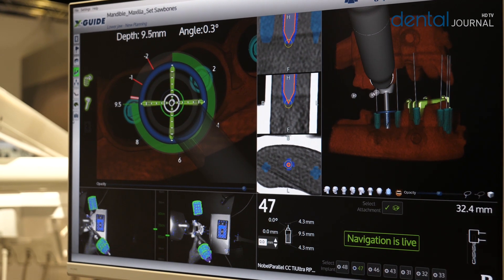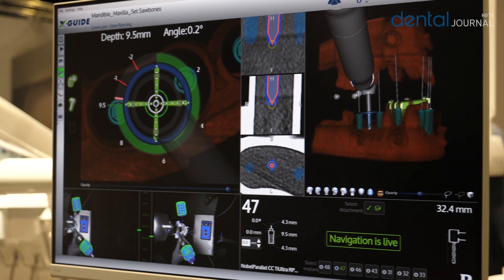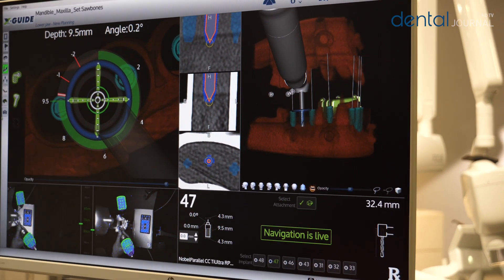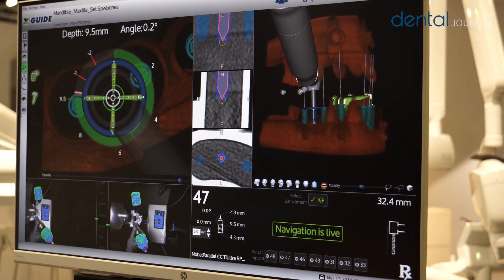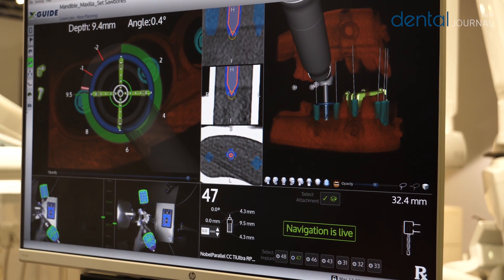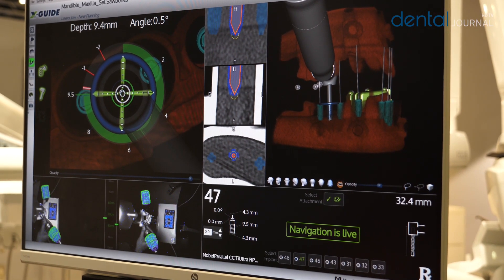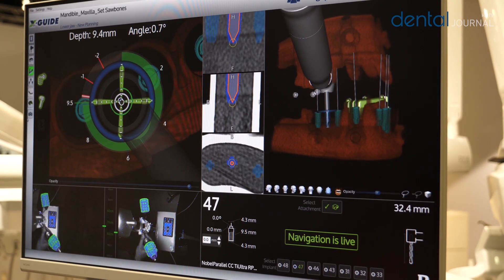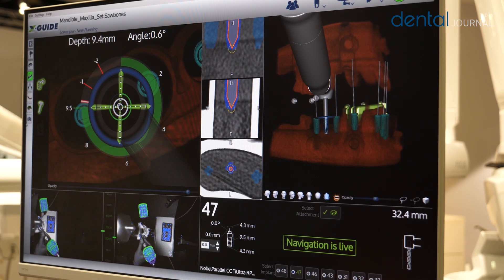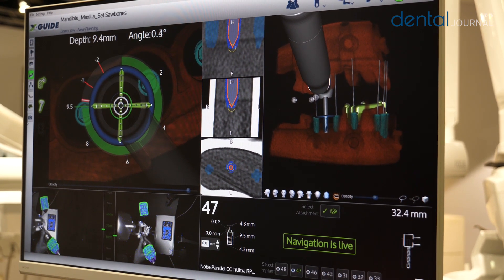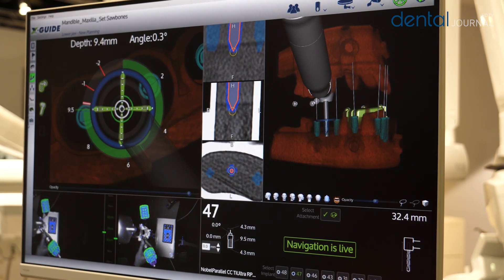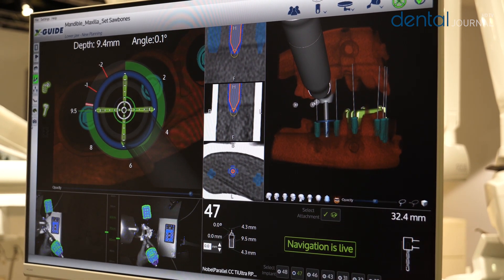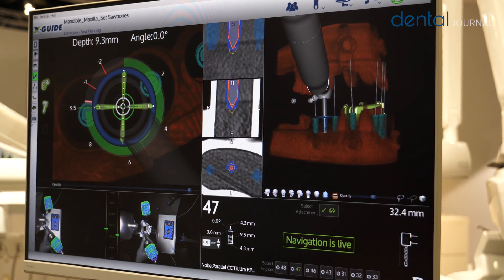Then on the right side of the screen, you can see cross sections of my planned implant position in the 2D DICOM information from my CBCT. As you can see, my drill is actually right in the middle of where I planned my implant, so it's quite accurate.